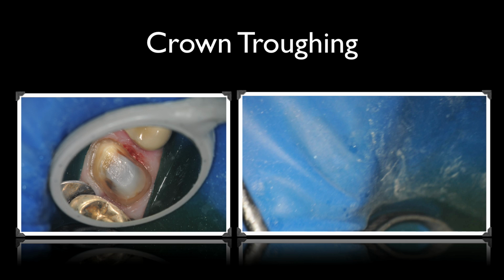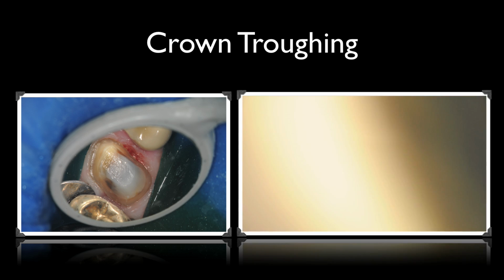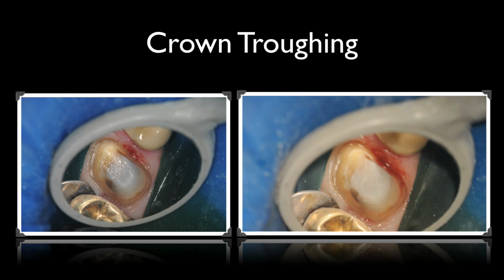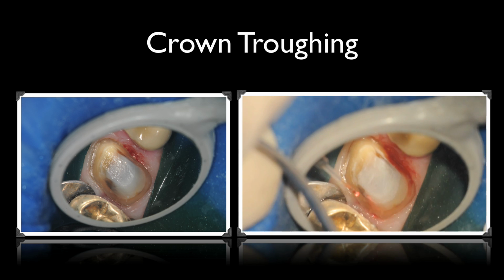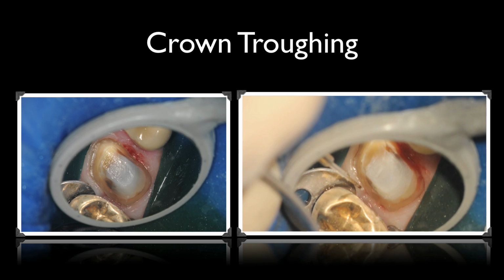So you can see there's the initial troughing that's been complete, and now what we'll have done is we put some Traxident into the tissue, push it down with a wet cotton pellet so that you get some hemostasis, and in addition you get some slight lateral distension of the tissue. On the right hand side you can see the preparation and diode tissue troughing that's complete.